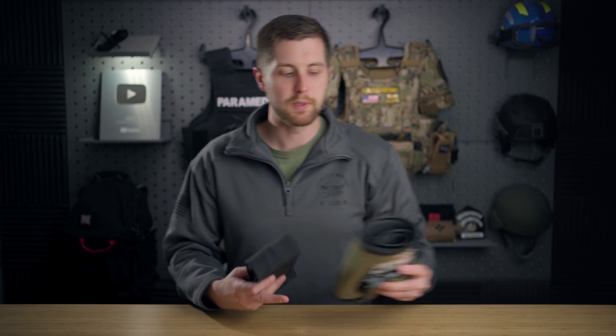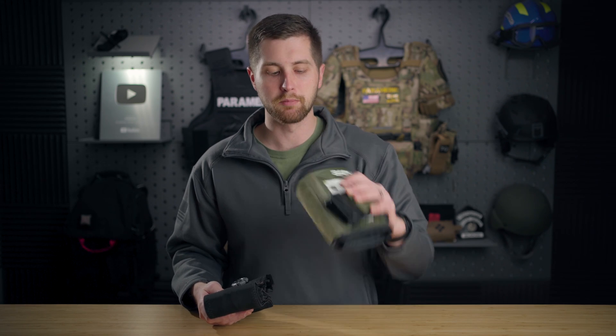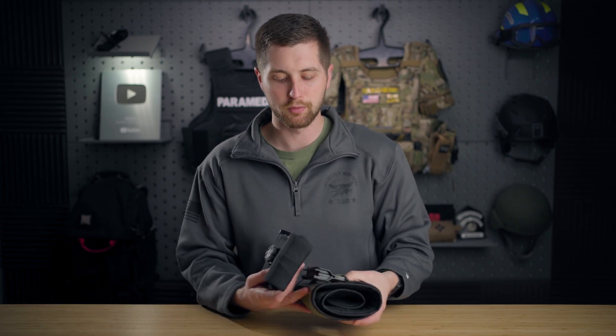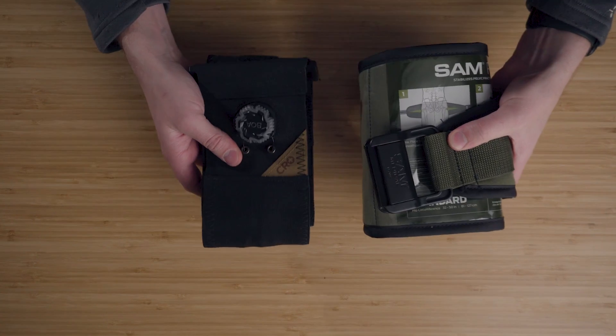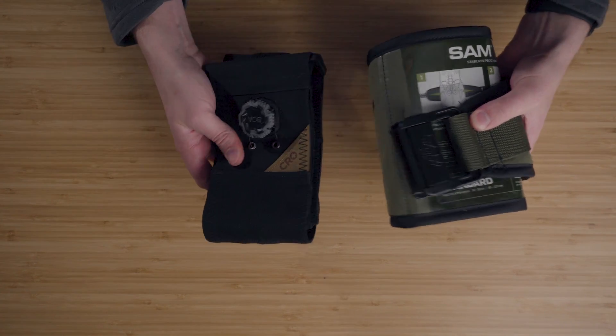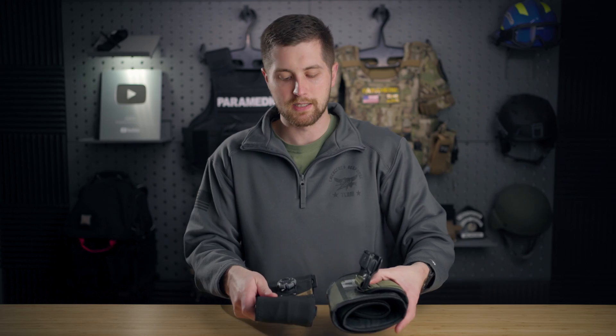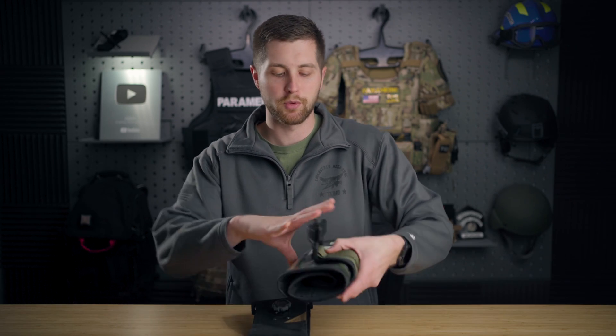Up until recently, I have been using the Sam Pelvic Sling in most of my personal kits. This is a good viable device. However, I've opted to switch over to the Crow for a couple reasons. First and foremost, I like the form factor of the Crow Medical kit a lot better just because it's thinner — it's not quite as wide. I'd say it's about three-fourths the size of that.